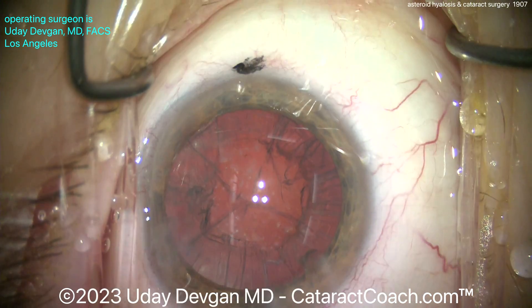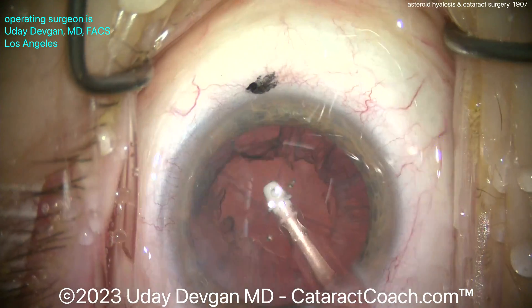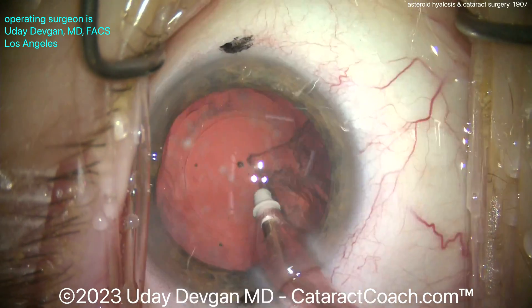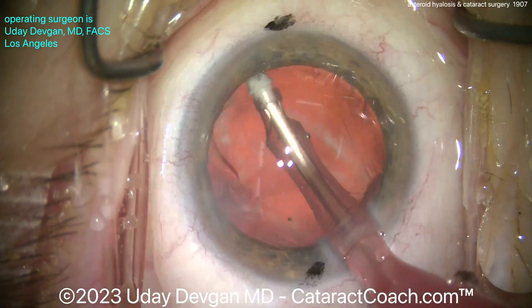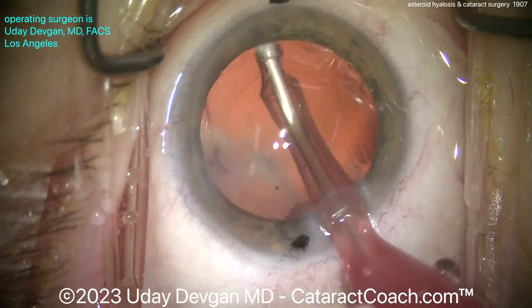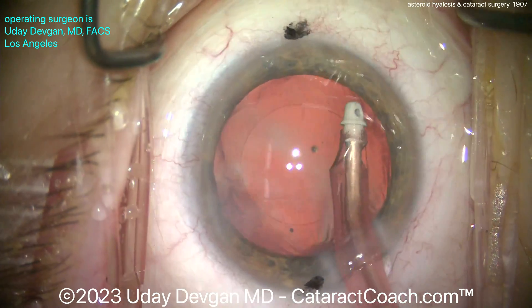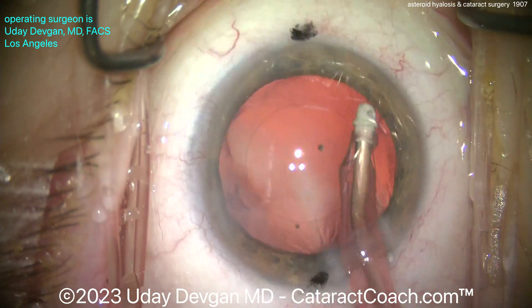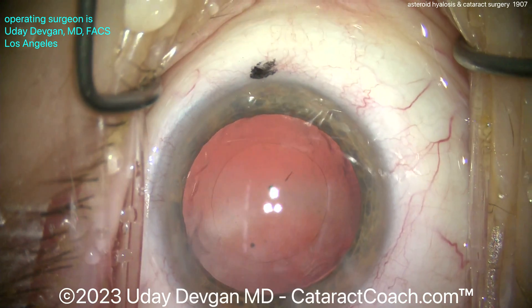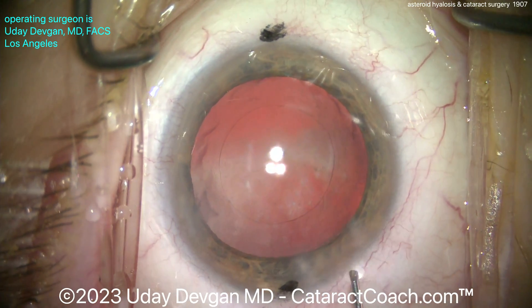In a case like this, I like to do a monofocal lens. This patient is about a +1 and wants to be emmetropic, so that's an easy decision. I have seen patients who had surgery elsewhere and received a trifocal lens and seemed pretty happy. Keep in mind — look at all those deposits back in the vitreous cavity, all those white spots — this patient does not notice them. The patient is completely asymptomatic; they're used to it, it's been there forever.